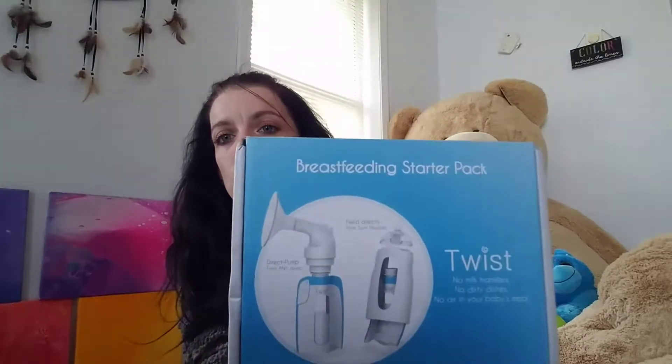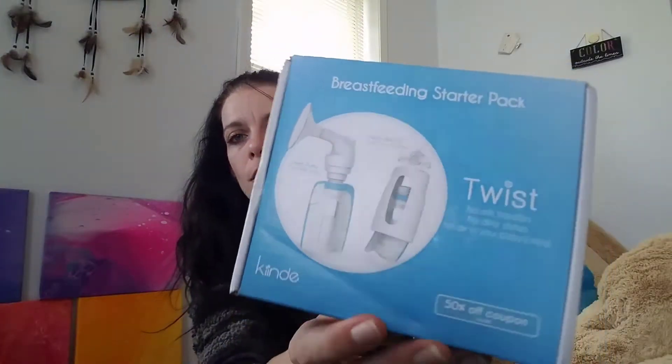Hi guys, so today I'm going to show you what comes with the Kiinde breastfeeding starter pack. To get this, you just go on their website and I believe it's six dollars for shipping and that's it.